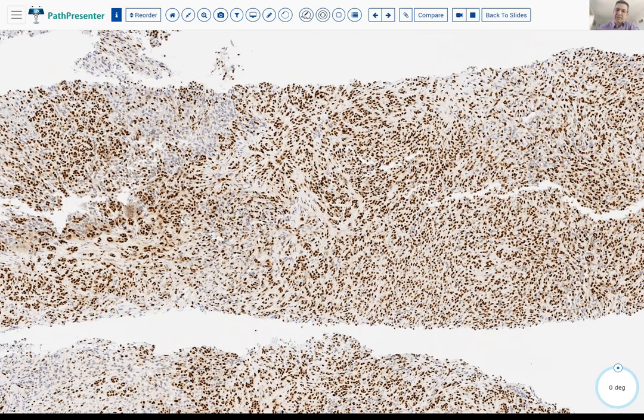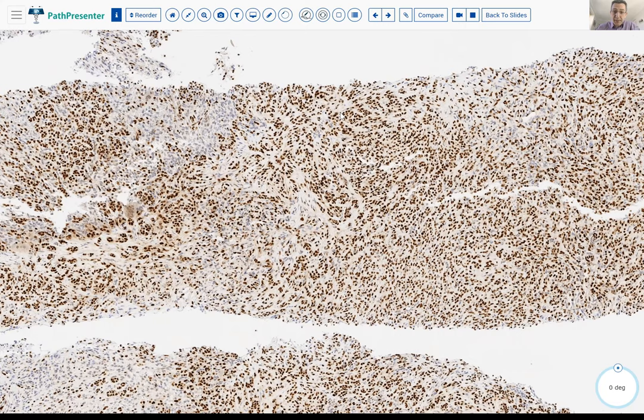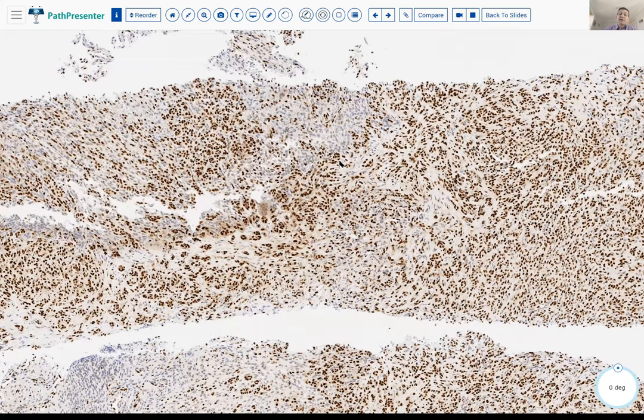This case was also positive for CD31 and is diffusely positive for ERG. The background non-neoplastic cells are negative, serving as an internal control. So this tumor is actually an epithelioid hemangioma. There are a lot of recent exciting discoveries about epithelioid hemangioma that I'll discuss now.